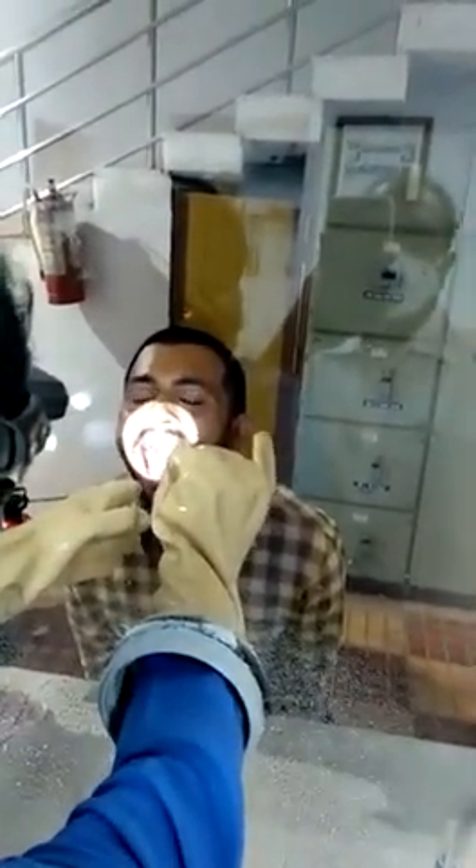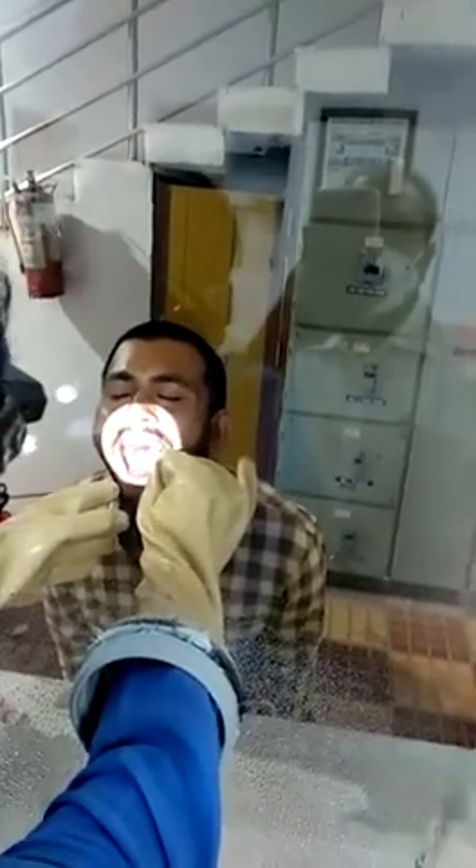The doctor is inserting the hands again through the glass pane. He has taken the swab, removing it and taking it out. That is the swab with which the sample is taken from the throat. That is the time when the patient is prone to cough, and that's when the glass pane helps in protecting the doctor.